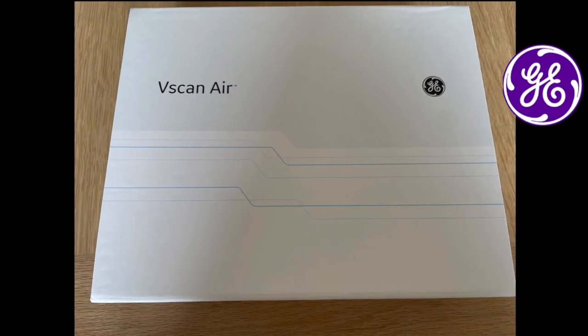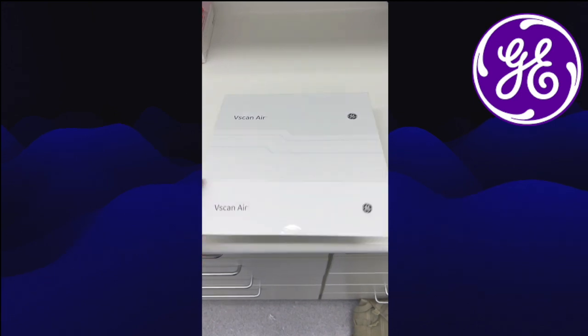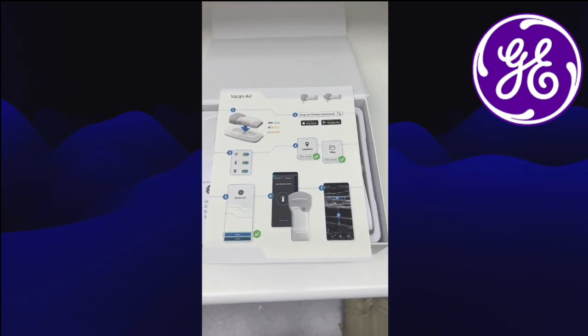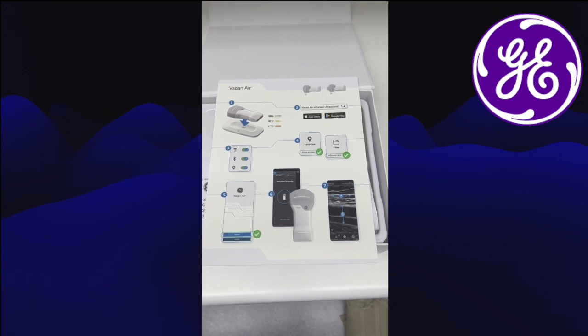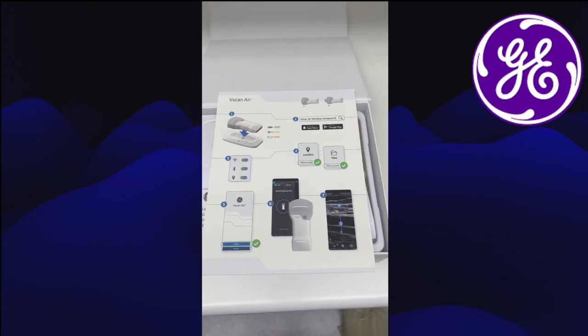Here is the box that arrived, courtesy of GE — we're very grateful to them for delivering it to us as the test site. Unboxing: inside the box we're confronted with a quick start-up guide. They've got a new charger, and the scanner will remain on in the charging dock itself, which is really handy — it won't switch off and disconnect from the phone, so you can be reviewing images or playing with the probe's functionality.